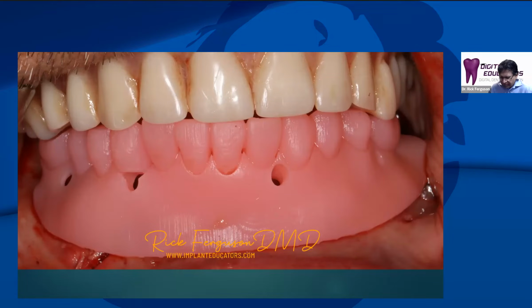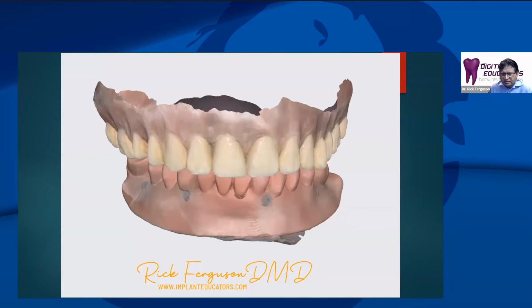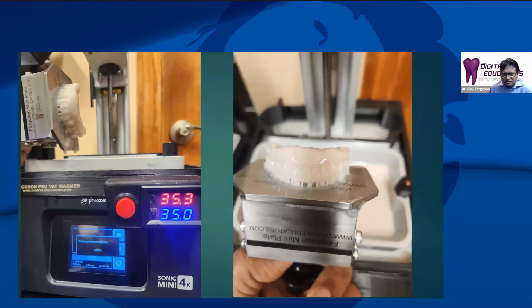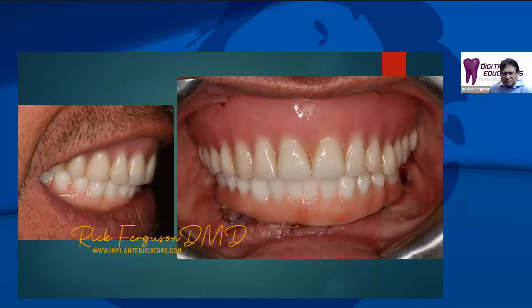And this was the hybrid prosthesis that we had printed as a denture, which we had designed in Blue Sky Plan to get the bite. And we actually used this with an impression technique to capture the implant positions in the vertical, then convert that into an actual hybrid prosthesis. And we use Exocad for this. This functionality is not actually available in Blue Sky Plan right now, hopefully in the future, but we're able to print directly to multi-units using the Rosen screws. Printed that prosthesis in about 30 minutes. And then, our assistant finished it using the pink materials, and the patient was able to go home.